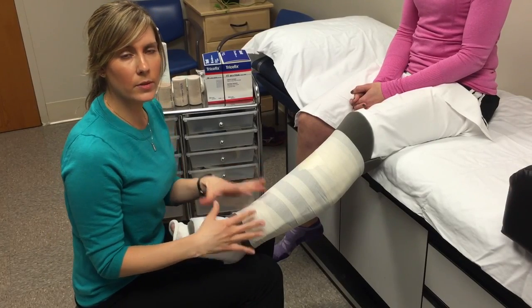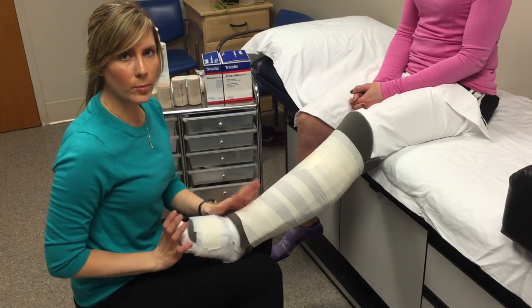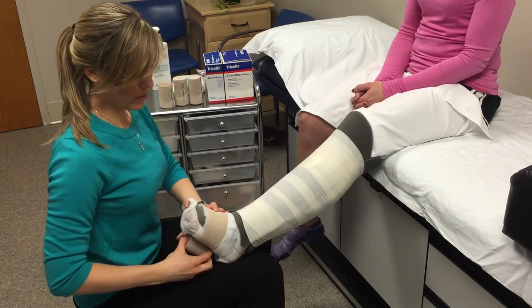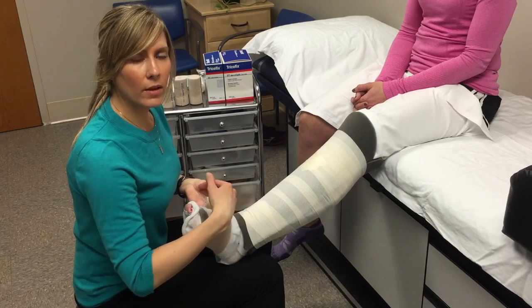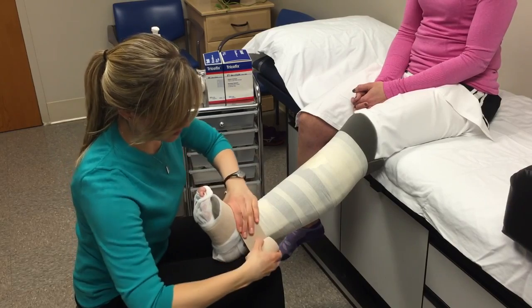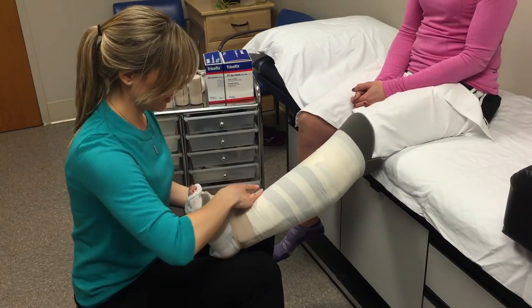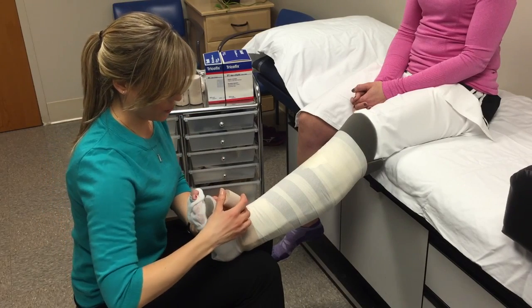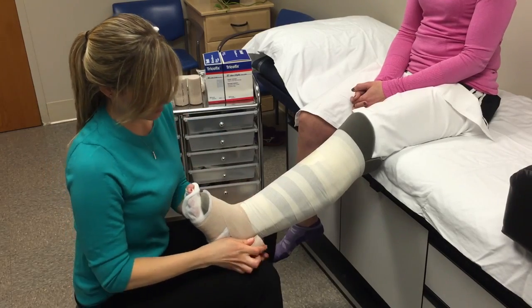Now that all the foam is secure, it's time to start with the smallest bandage that your therapist gave you. The use of the bandages varies from person to person, so always refer to what your therapist prepared for you. We'll do one or two loops around the top of the foot to anchor the bandage. Then we're doing what might look like a figure eight or a roman sandal, where you have her flex her foot up and then go across the front just above the heel, using your other hand to smooth things out and apply a little more compression. Come down and then again around the foot. You're only pulling about 50% and smoothing it down, then repeat that several times.